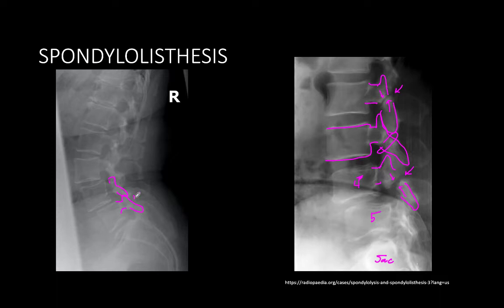The pars is intact: L5, L4, here's the pars of L3, here's the pars of L2, here's the pars of L1. All these structures are intact, and we see these anterolistheses. So we're thinking, how is this possible? You'll note the intervertebral disc degeneration. I've kind of covered up the facet degeneration associated with these levels, but facet joint hypertrophy and sclerosis, perfect sign of degeneration. This patient has degenerative anterolistheses.